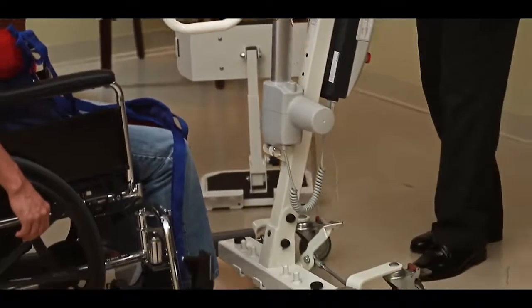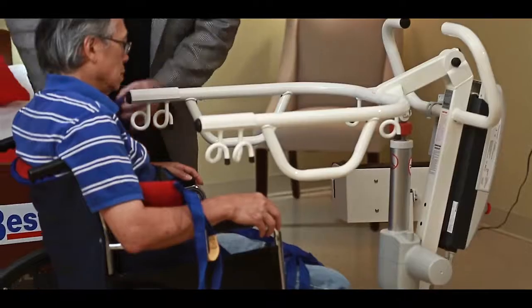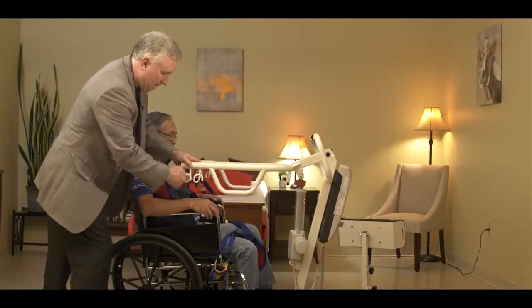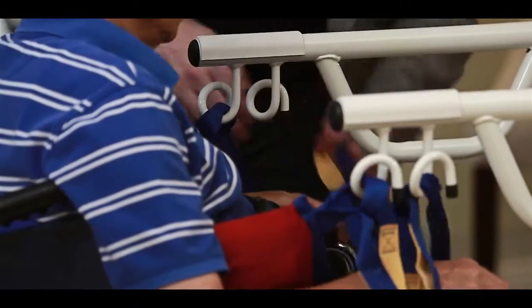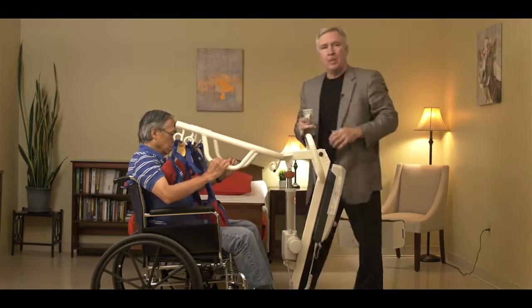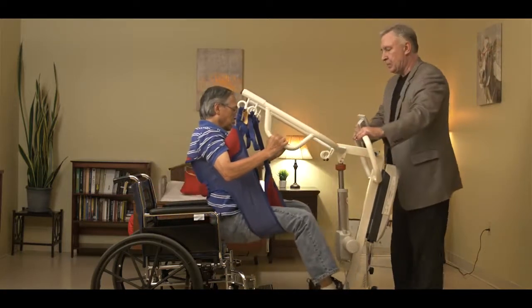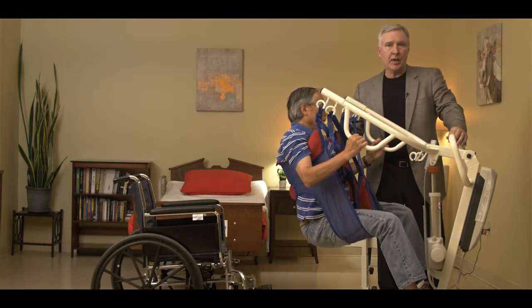Now we're going to connect the Sani sling to the spreader bar. Take the shoulder loops and connect them to the first set of hooks at the lowest loop position. Take the leg loops and connect them to the second set of hooks in the front at the lowest position. Hit the up button on the lift and raise the patient out of the chair. As you can see, the patient is completely supported by the sling. Now you can see that we have the ability to transfer a patient who bears no weight with the Sani sling and the SA products.